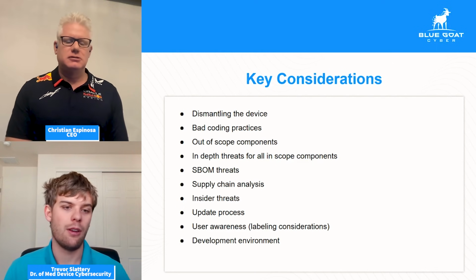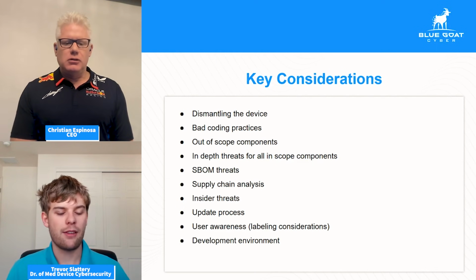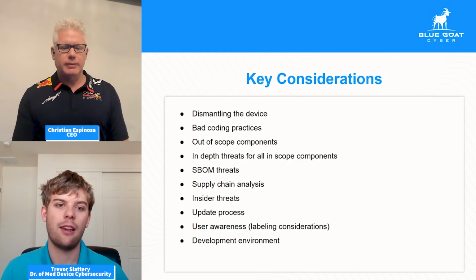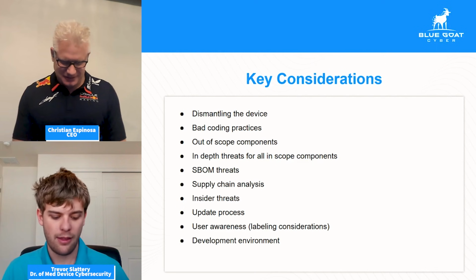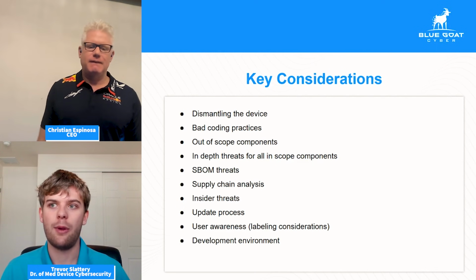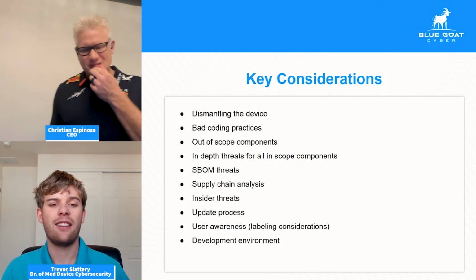Another huge one that we see all the time is bad coding practices. So this is something that we want to have as a threat due to its prevalence in the real world. We get devices all the time that have vulnerabilities through insecure memory handling or just insecure functionality, lack of data sanitization, hard-coded credentials, things like that. These coding practices can introduce a lot of risk into the device, and it's very important that we catch those. Easiest mitigation is always just going to be education to developers and regular static testing. Static testing can't catch everything.